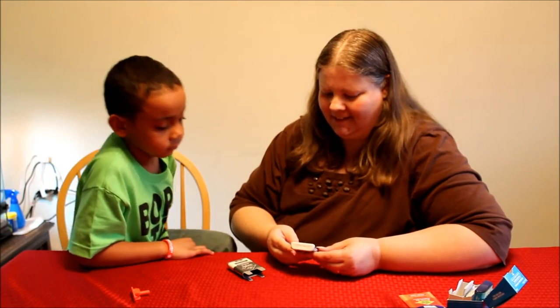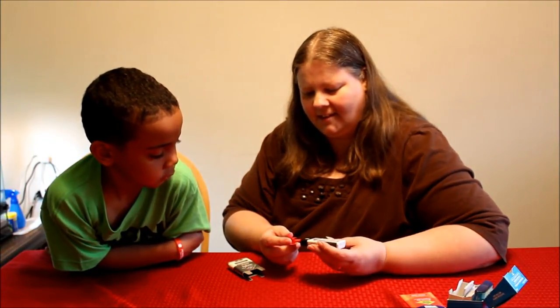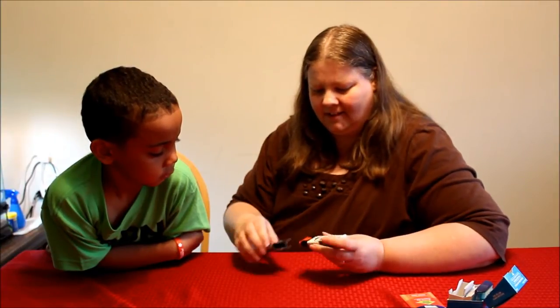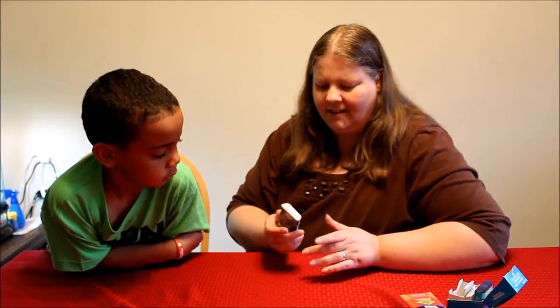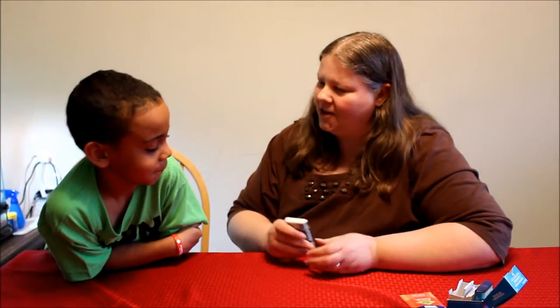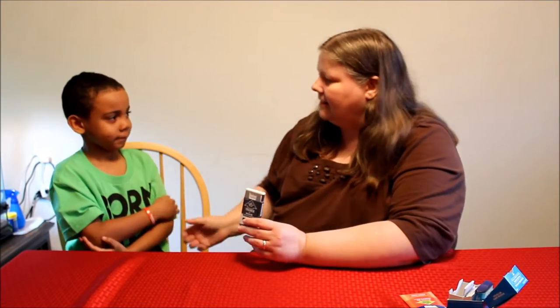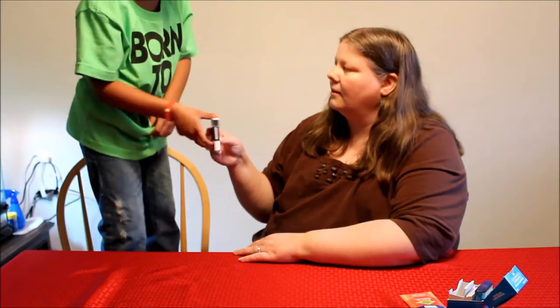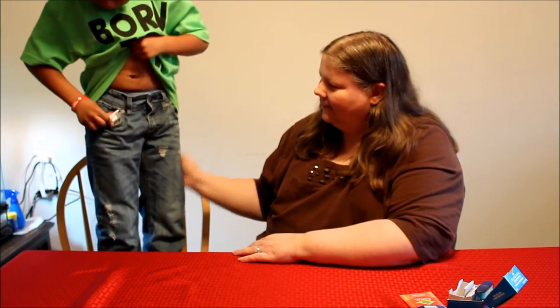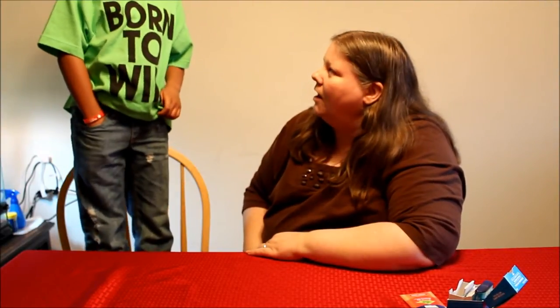So what do you think of that? Were you able to hear it? You can hear it well — yeah! Do you want to try it again? I like it because — let's say you put this in your pocket — oh man, that's nice, just like a wallet in your pocket!